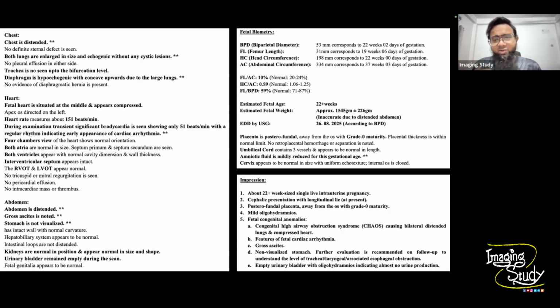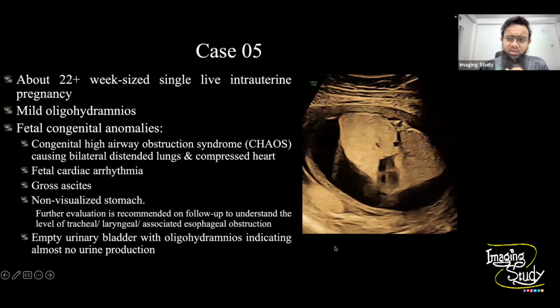So we need to give something to our clinician. So that's why it's still practiced in our country. So it may differ from country to country. And yeah, we said many things. So just summarize it here.